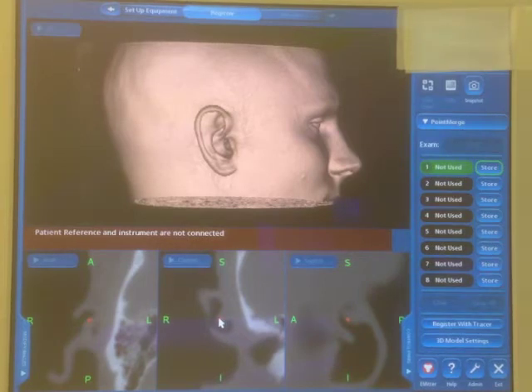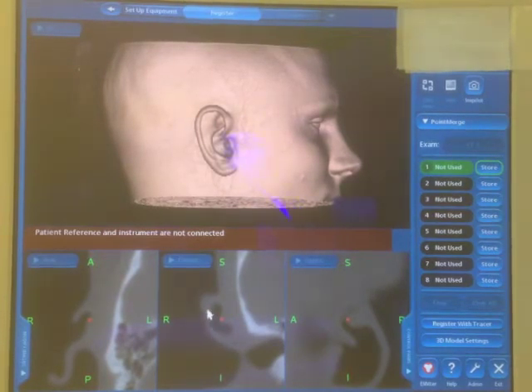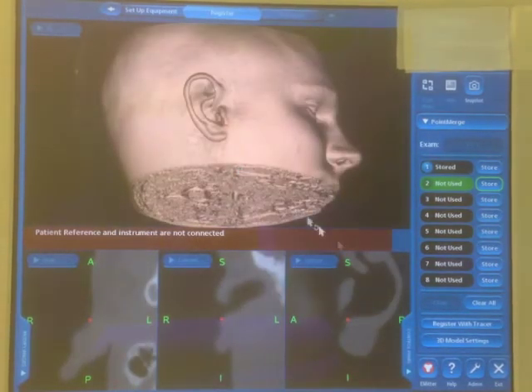So here you see on this coronal the juncture of where the antihelix and the helix just crosses over it, and you can see I'm climbing up on the sagittal until I see a solid bar here on the helix, and then I usually pick a point just about a millimeter in, because when we rest our probe on the skin it'll be pushed in about a millimeter. I'll store that. The next one we're going to do is the tragus antitragus.